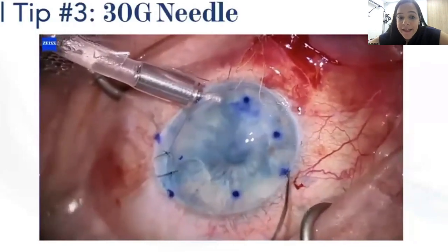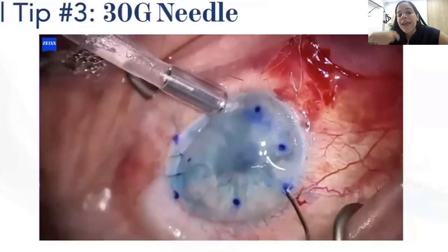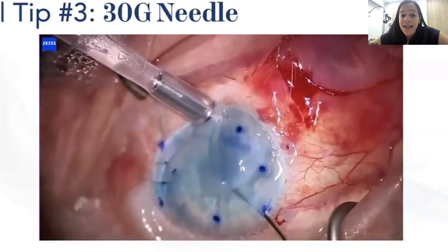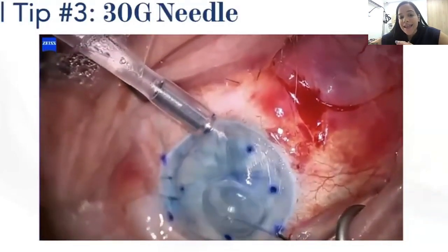Another tip is you can take a 30 gauge needle, bend the tip, and go in. Touch your graft only in one position, because in that position you will have endothelial cell loss, and move the graft. Then when it's in the right position, you inject air.